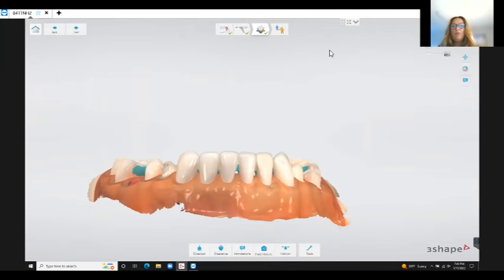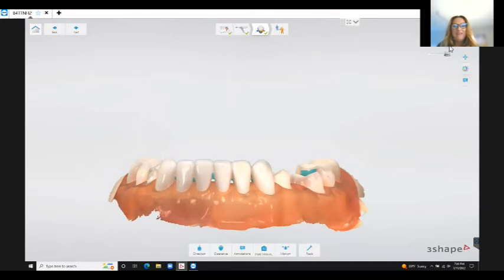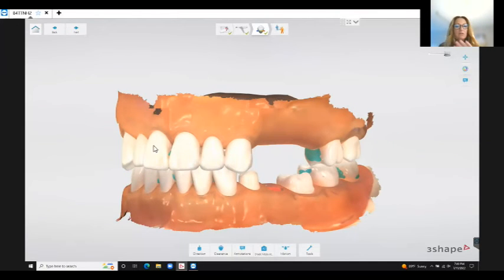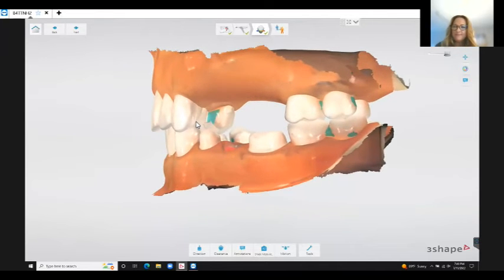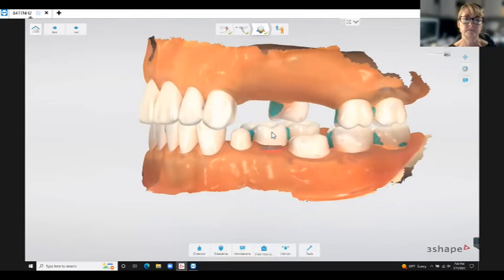Yes, and I'm going to add for the post process, for those of us that are auxiliary, I like to post process, bring the doctor in so he can check it before it's sent out. Yes, absolutely.